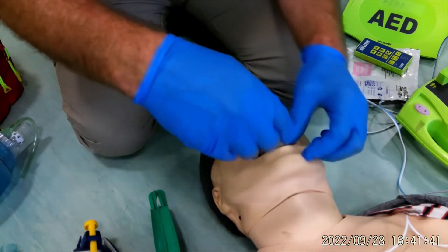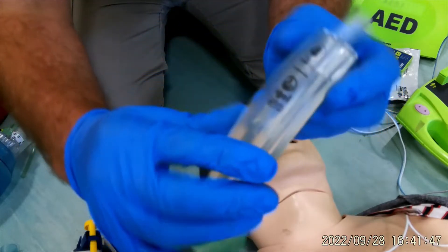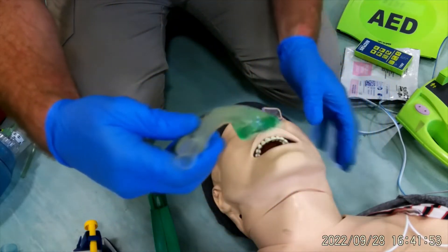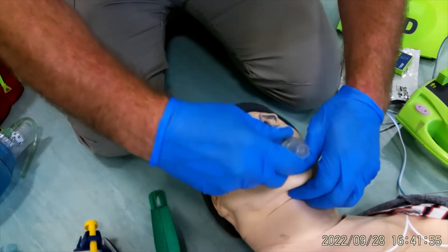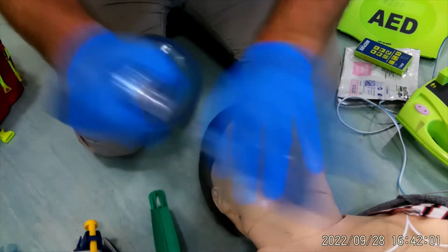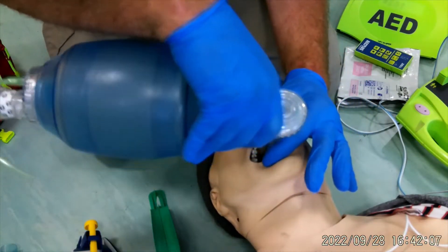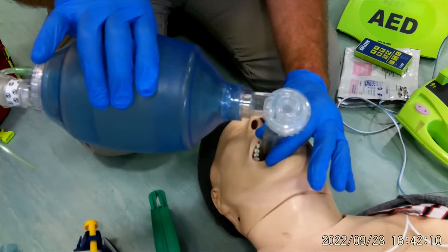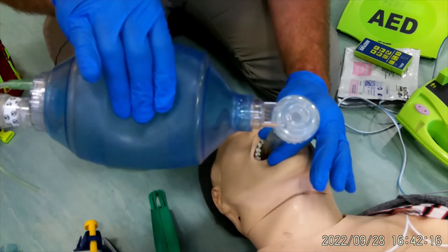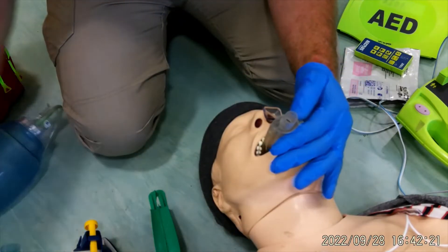On this particular mannequin it sits a little bit high, but keep an eye on the bite block — ideally the incisors are level with the mark on it. If needed, you can get a little deeper rotation to get it about right. I remove the mask, hold the i-gel in place, place the BVM on top, ask my colleague to stop chest compressions, and squeeze about a third of the bag to test it. If I'm happy, I remove the bag valve and mask.